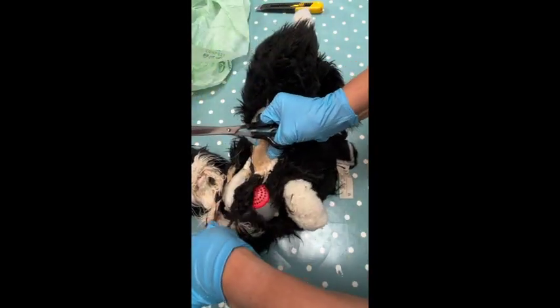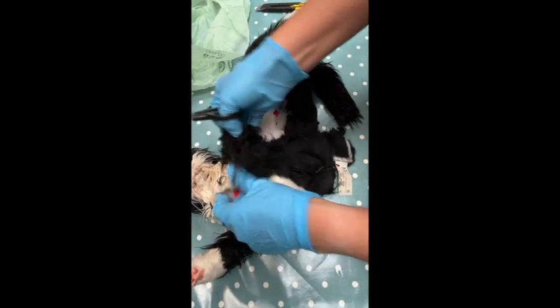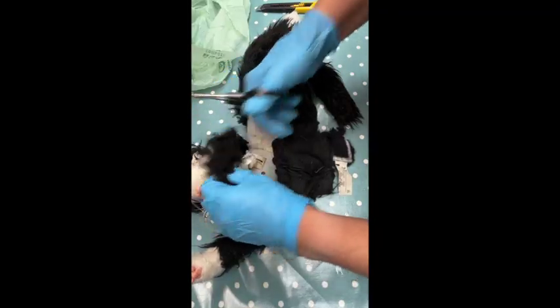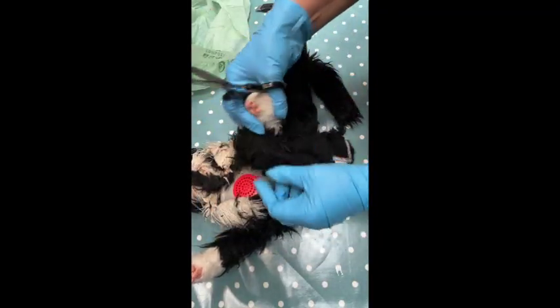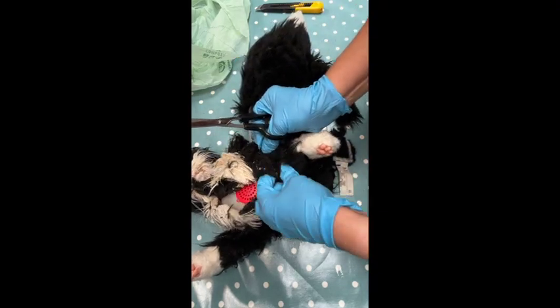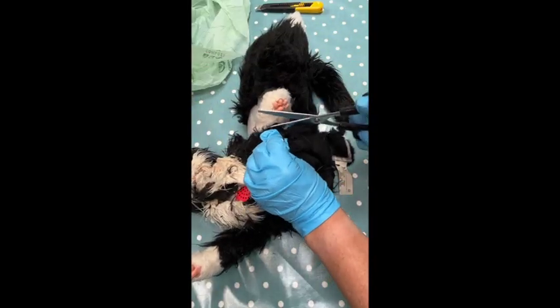Okay, so still not really finding a big chunk of food, which is what I was expecting. This bit does not seem to ever want to come off. There's loads of food embedded in the fur here. That might be where the smell's coming from.